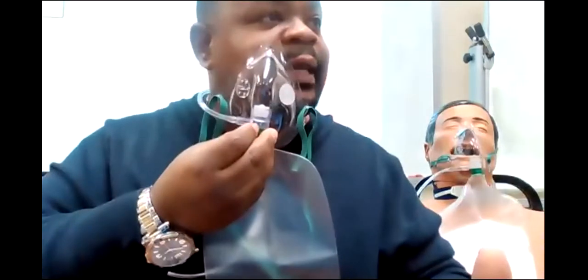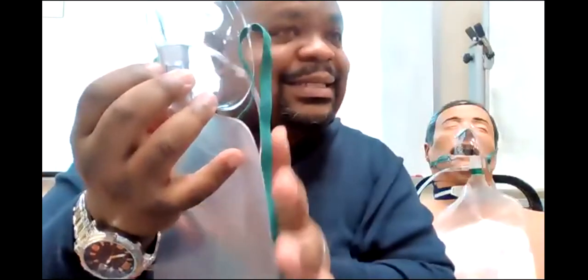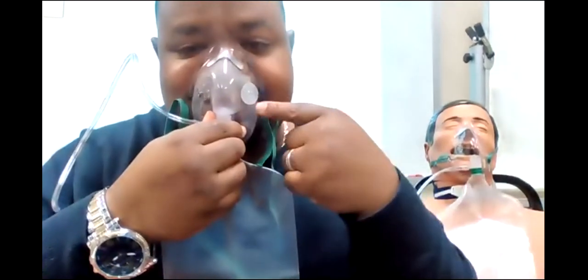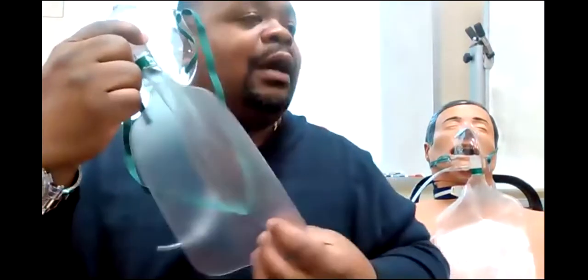But what about when I suck in? When I suck in, this is blocked. It can't get in, right? I can't get any outside air. So if I can't get outside air from out here, and I can only get the gas that's in this bag, then I'm getting 100% oxygen. I'm not pushing my air in, so it's not a partial rebreather. This is a non-rebreather. When I exhale, my CO2 doesn't go in the bag, but comes out here. When I inhale, I try to inhale this way, can't get it. I can only get the gas coming from the bag, and this is all oxygen. That is the difference between a non-rebreather and a partial rebreather.